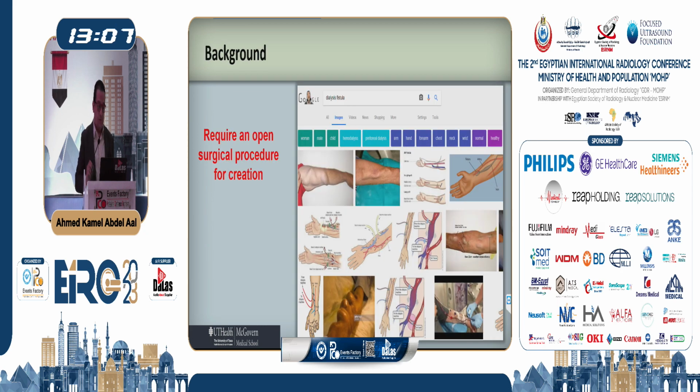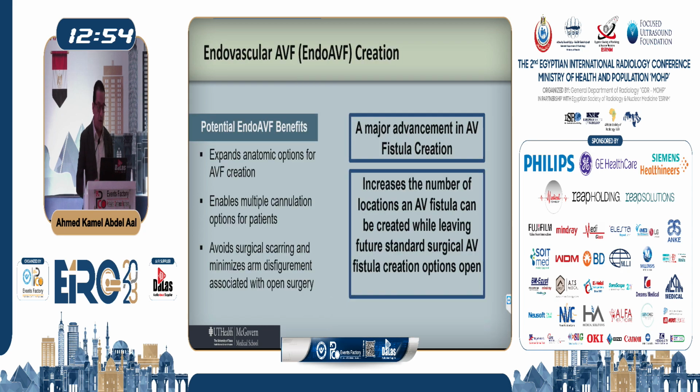If you just Google dialysis fistula, just like I did here, this is what you're going to get. You see all these very dilated, aneurysmal, very disfiguring changes to the arm. This is what the surgical fistula is going to create.